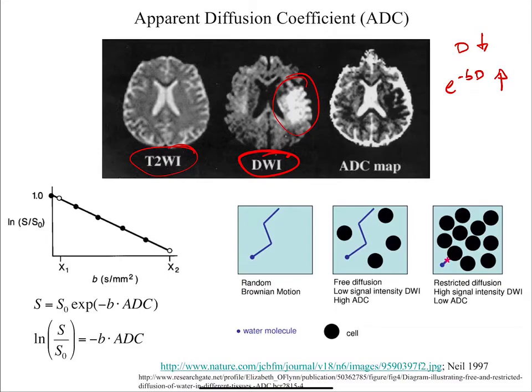How long would it take to do all of these tests? It depends on the resolution. You might want to do a 30-minute exam. But if the person was okay and you were doing more research, you might make it an hour long. But typically, I think people would like to get it in less than 30 minutes. And I know that in our department, I think the goal is to try to get it down to 10 minutes. But there's always going to be a trade-off. Okay? And we'll talk about some ways of reducing that trade-off in the last half.